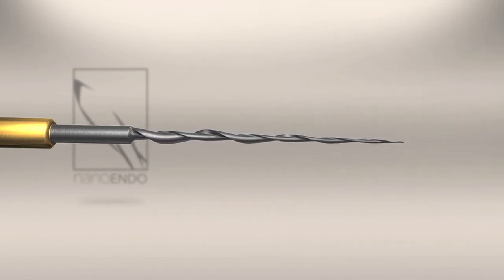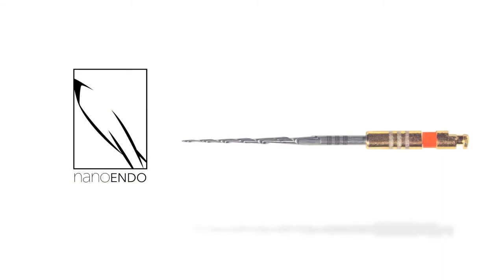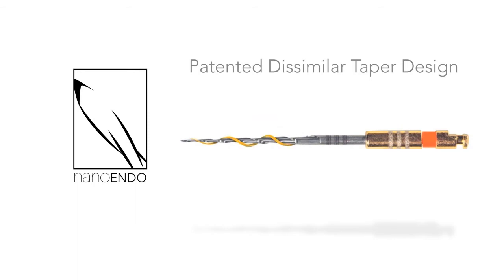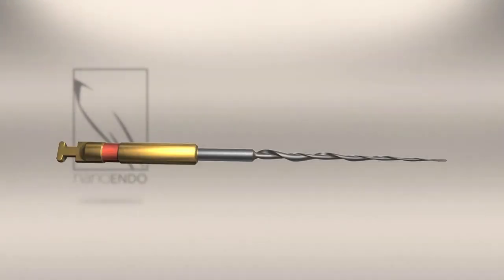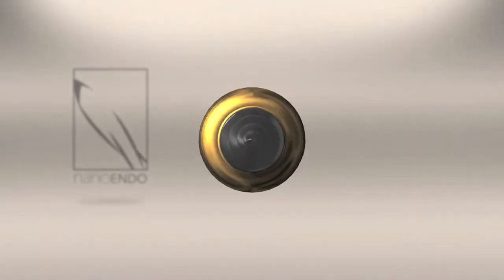The 1ENDO file's remarkable ability to resist becoming bound or broken continues throughout the remainder of its working length, thanks to NanoENDO's patented design having two unequal tapers side-by-side within the same file. These unequal tapers exact a unique and highly desirable effect. As the file's smaller tapered flute progresses toward the handle, its cutting edge projects proportionally less than that of its larger tapered counterpart. We can see this as the 1ENDO file's cross-sectional profile continuously changes along its working length.